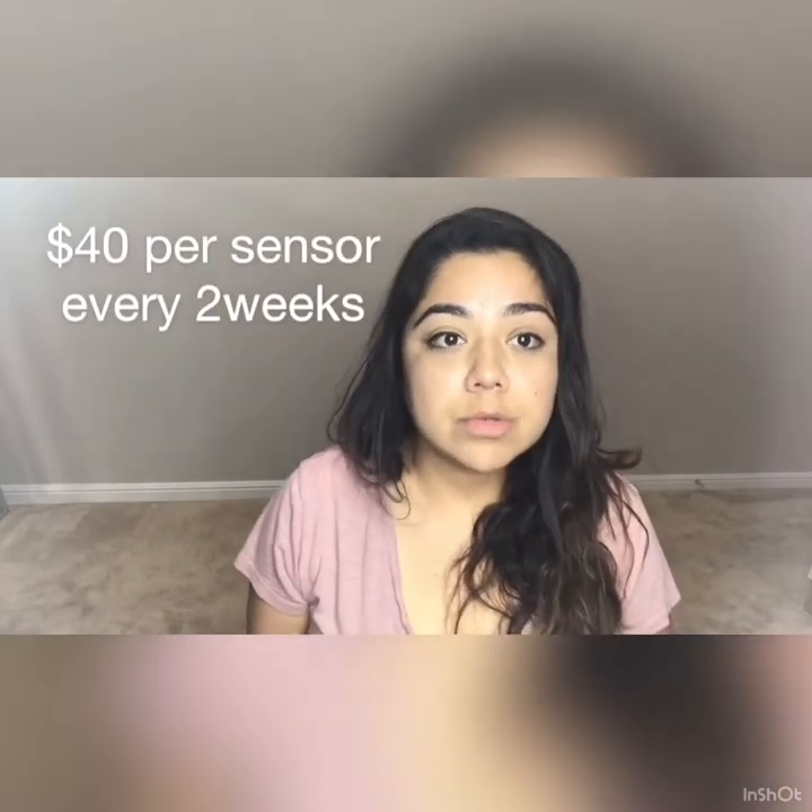My insurance did not cover the Freestyle Libre — they're about $40 a sensor without insurance. Some patients have gotten their doctors to write that they need to read their glucose multiple times, like five-plus times a day, for certain insurances to cover it. It is $80 for the pack — this is what it looks like.